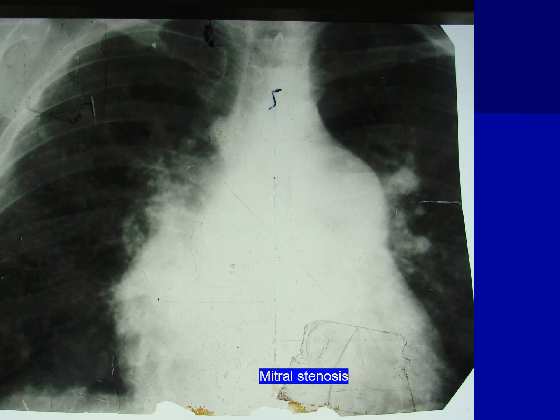That image shows us mitral stenosis of the heart. Mitral heart shape, second and third arches are enlarged. The heart waist disappears, and also the atriovasal angle, which is on the right side, goes upwards. With mitral stenosis, we may also see changes not only in heart shape but also in lung tissues. Here is the heart of the patient and lungs with hemosiderosis.